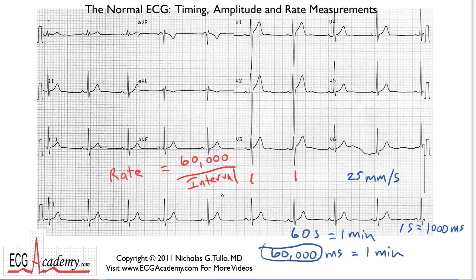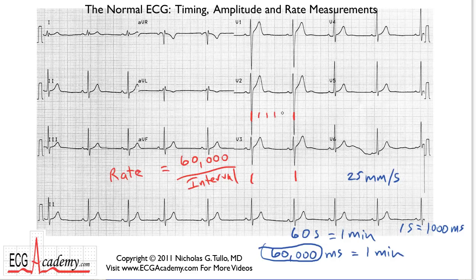So how do you figure that out? You simply count — knowing that each big box equals 200 milliseconds. Make it easy on yourself: scan the ECG and look for a QRS complex that lands on a heavy line. Then measure how many milliseconds it is from one beat to the next. Counting off: 200, 400, 600, 800, 1000 — and looking carefully, this turns out to be 1100. Taking 60,000 divided by 1100 gives you about 55 beats per minute.